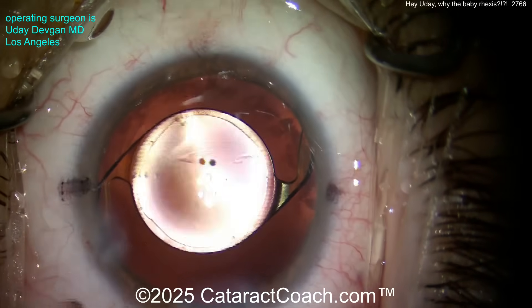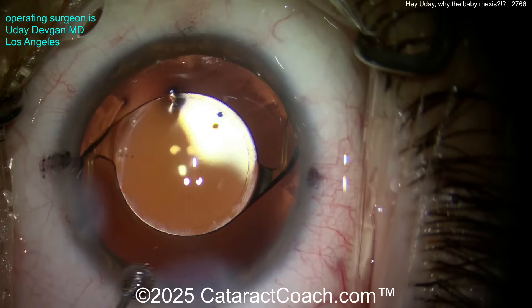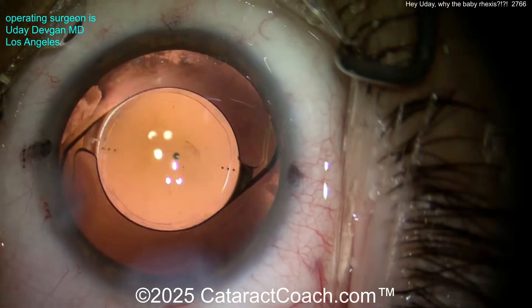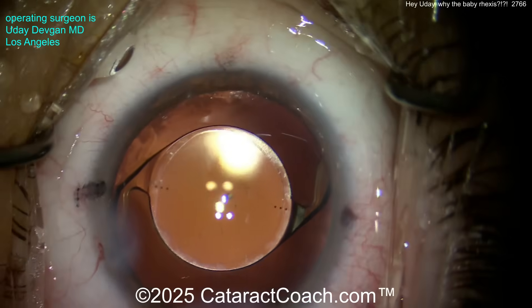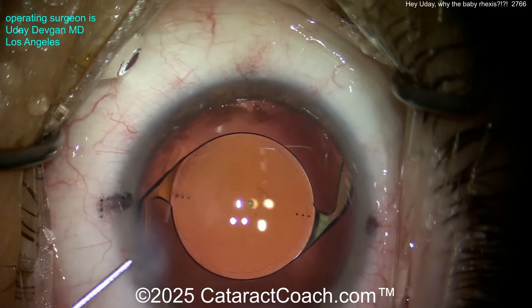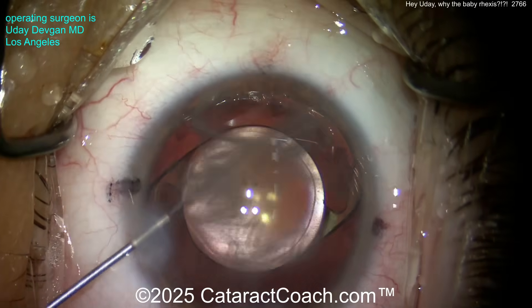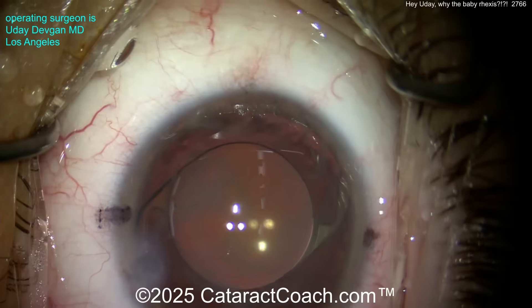Final positioning on that toric lens — beautiful, exactly what we wanted. So yeah, it was not a baby rhexis, believe me. I heed my own advice: no baby rhexis. Every time you're making that small rhexis, just think — Cataract Coach says, 'No baby rhexis.'